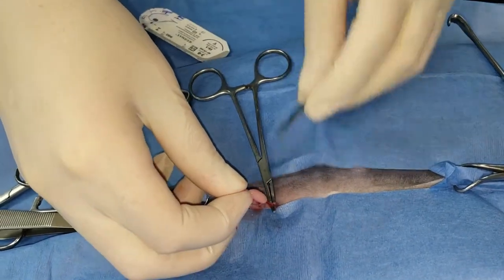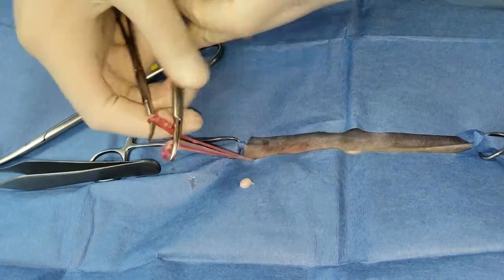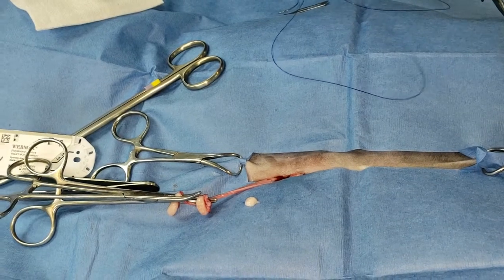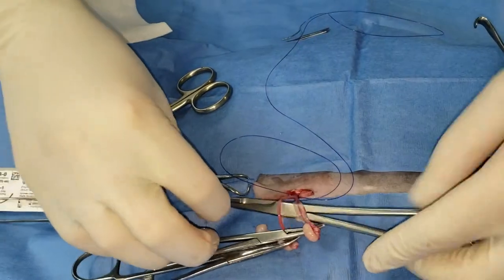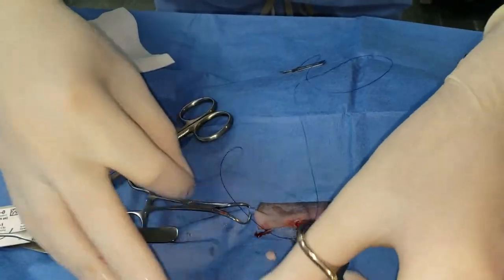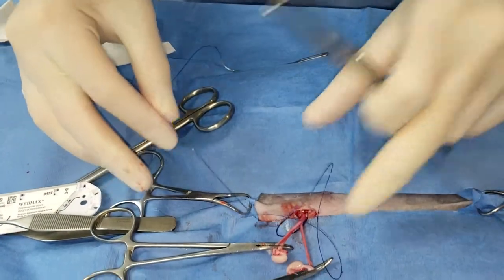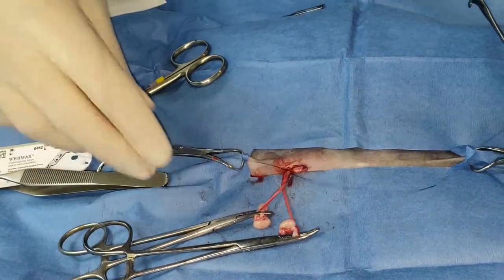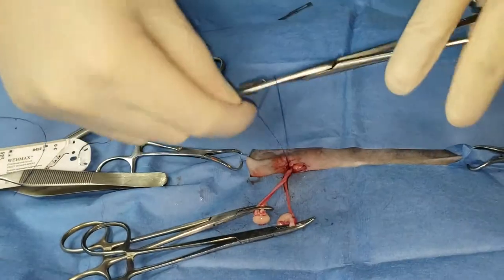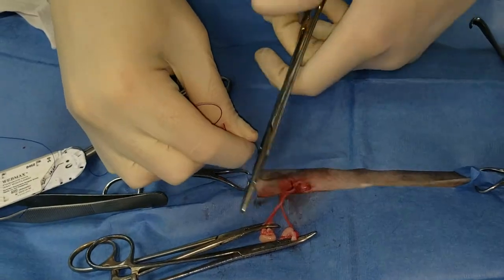I only do that blade technique for dog and cat spays and it's always way away from the incision. I pull caudally on the uterine horns and it usually breaks down the broad ligament in cats every single time. Then at this point I just ligate the whole thing with a Miller's instrument tie — this may actually be a constrictor knot; the terminology is still somewhat unclear. Basically you make a loop and wrap one strand around and pull through — there are demonstrations on YouTube and in articles. Then I place four square throws on top of that. This is what I do on small dogs and cats; if it's anything bigger I'll probably do a transfixation if the arteries are large.